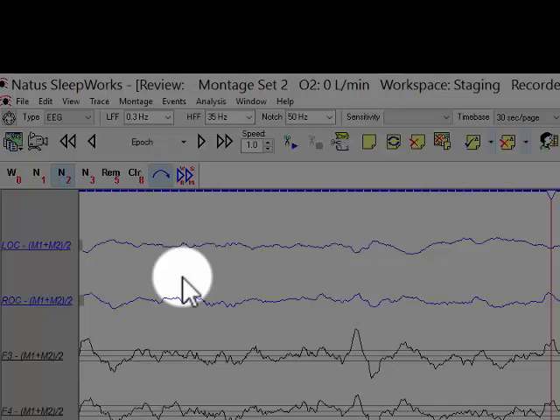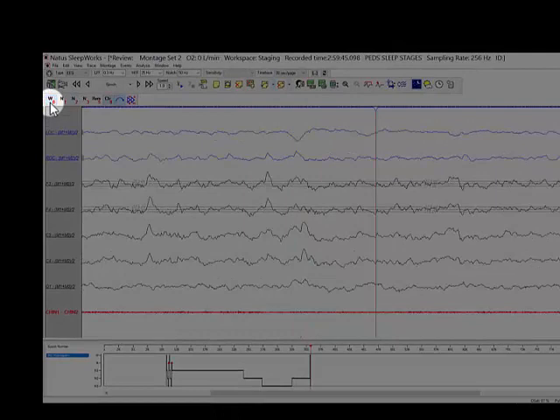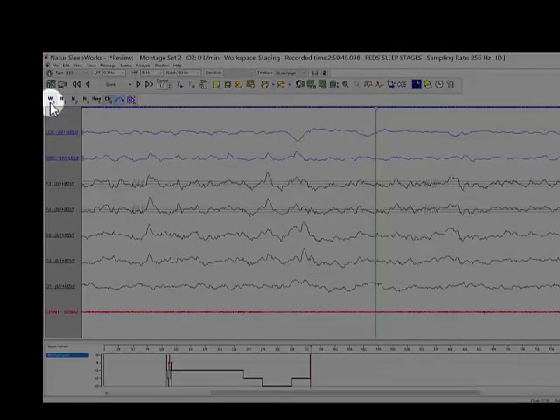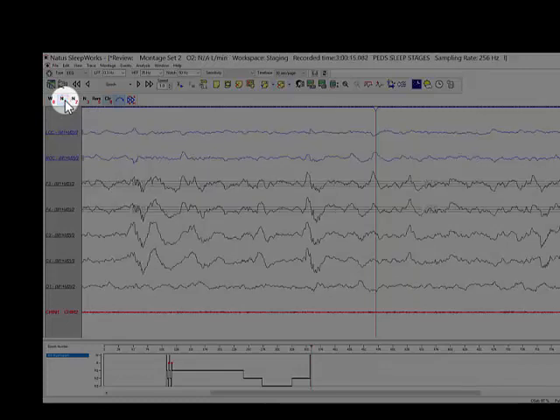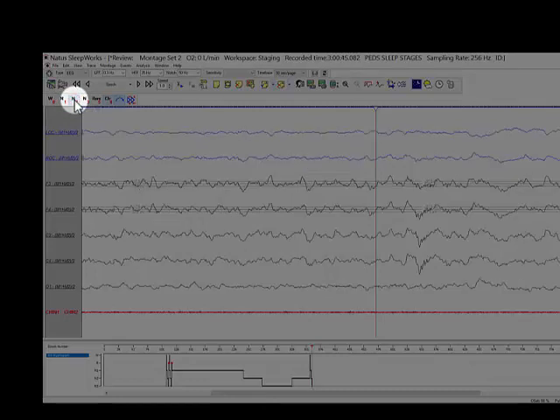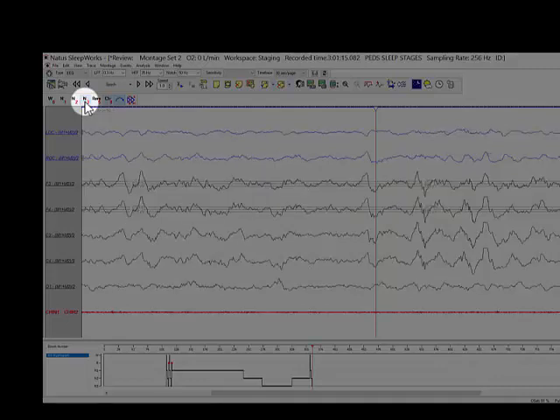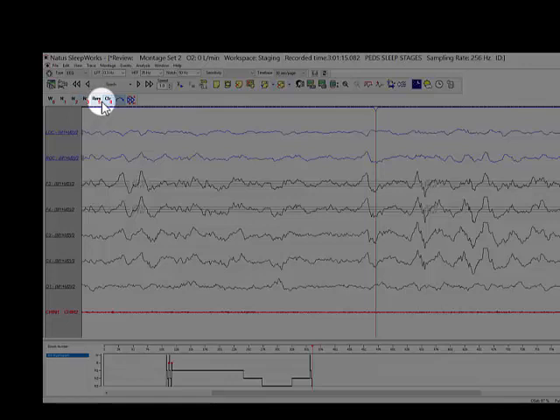Assign a stage to each epoch using the staging toolbar. Pin the appropriate stage. For example, this epoch is stage W, so you pin W. This epoch is N1, so we pin N1. This epoch is N2, so we press N2. This epoch is N3, so we press N3. This epoch is stage R, so we select REM.